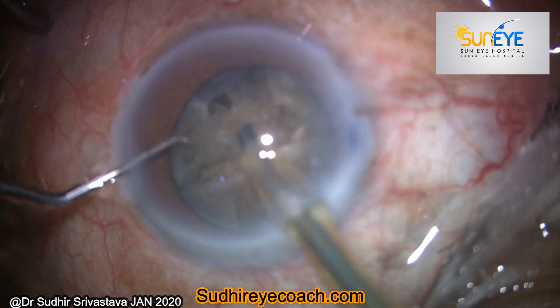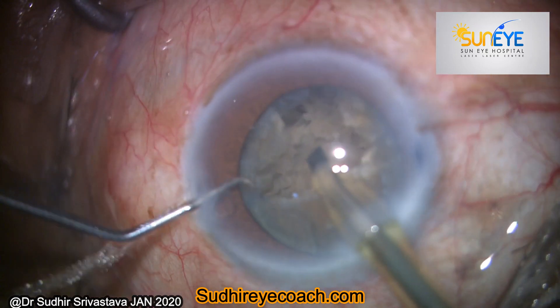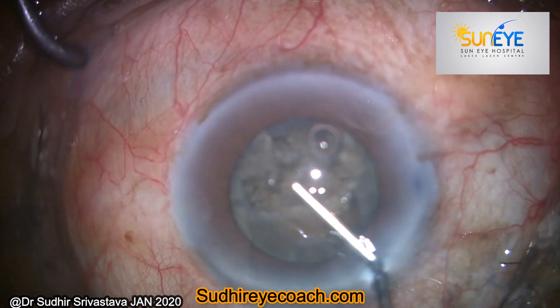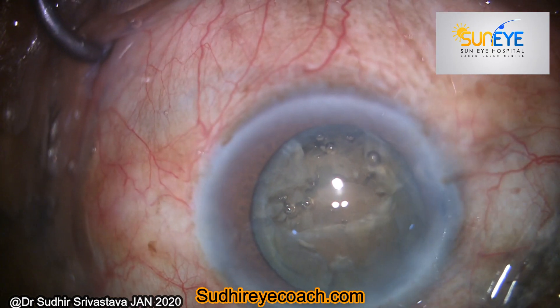During the process of fragmentation, you can see that the side port incision of my second instrument was leaking profusely, and this is not a good sign for closed-chamber safe phacoemulsification.